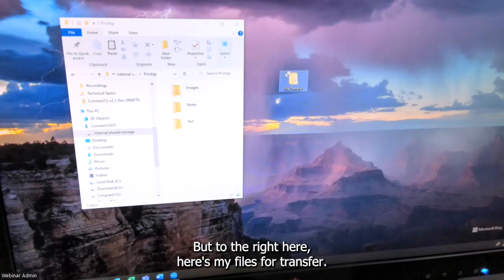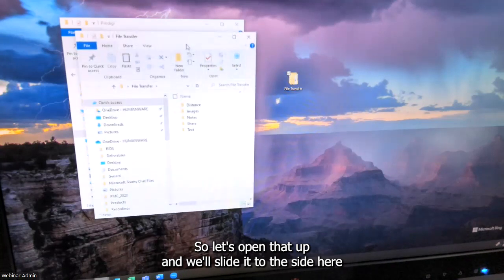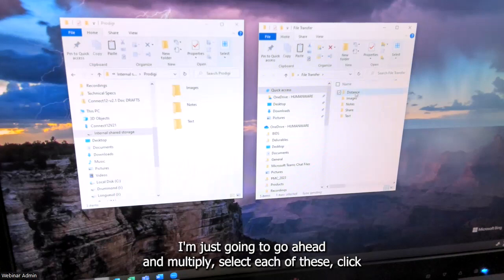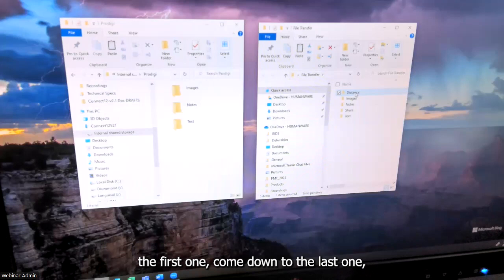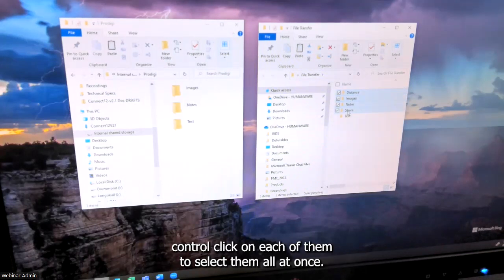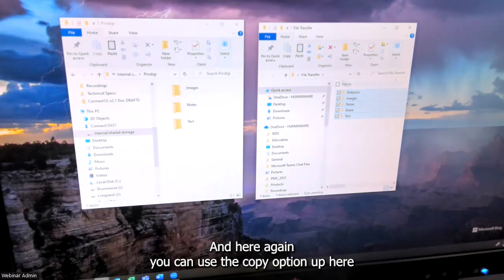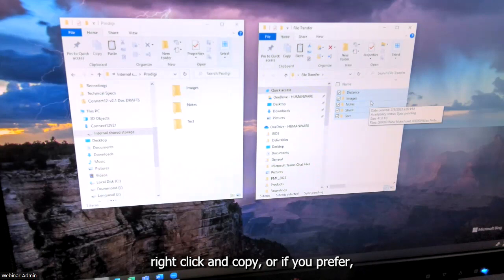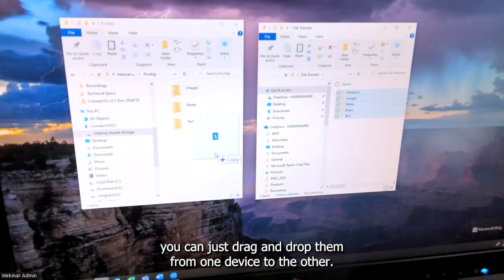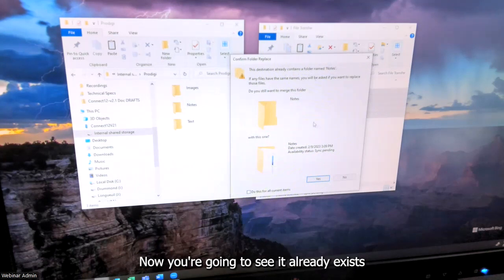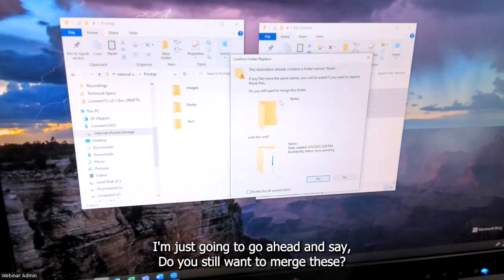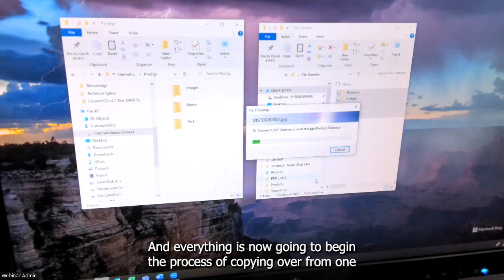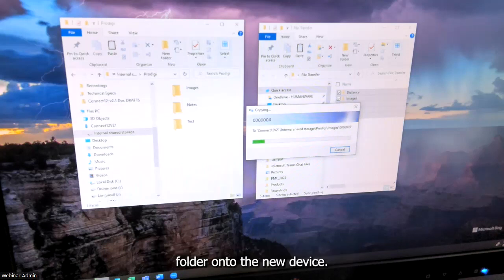To the right here is my file transfer folder. Let's open that up and slide it to the side so you can see: on the left is my new device's Connect 12 Prodigi folder, and to the right is my old device's files. I'm going to multi-select each of these — click the first one, come down to the last one, and control-click to select them all at once. You can use the copy option up top, Control+C, right-click and copy, or just drag and drop from one device to the other. A prompt says it already exists; since I know these are empty on my new device, I'll choose "Do this for all items" and click Yes.